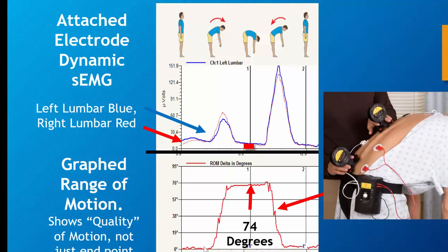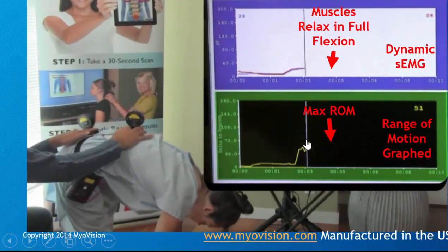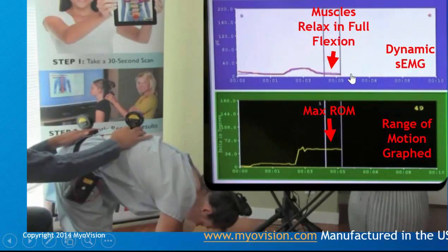Our range of motion is graphed down here with our endpoint range in the center. The key is we're graphing the quality of motion. Here you can see we're graphing range of motion at the bottom and the muscle response simultaneously.